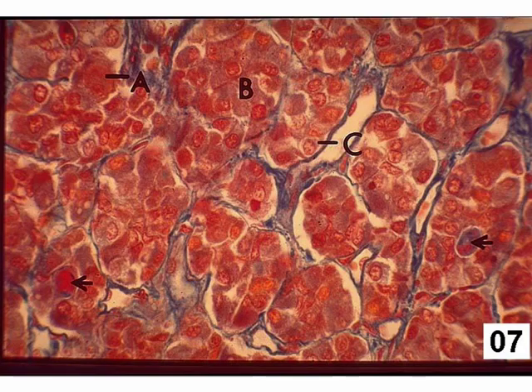So now we're looking at a high magnification light micrograph, because you can now easily make out nuclei and even small nucleoli within the nuclei, and you can see the cytoplasm surrounding the cells. You'll note that these cells are arranged in clusters, or what we call cords.